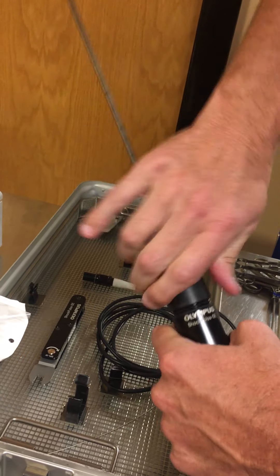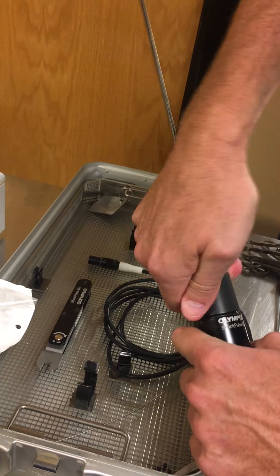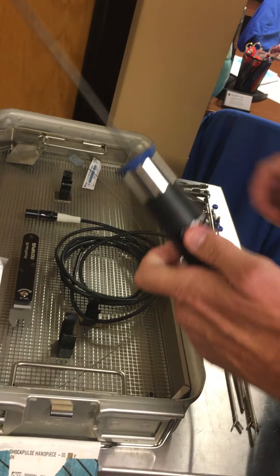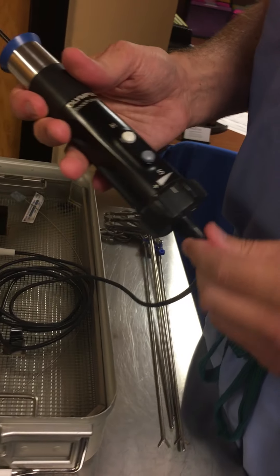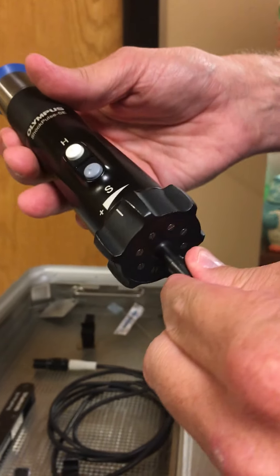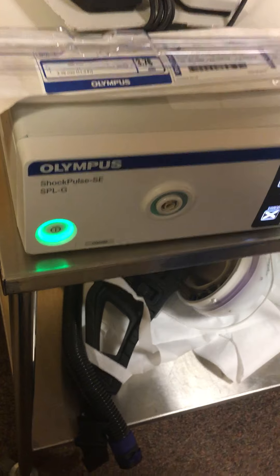Next, take the nose cone and simply slide it over the probe. Apply a little pressure, turn it clockwise — it's going to be a little squeaky — and tighten it down. The rear of the nose cone is where suction attaches, so you'll have suction tubing in the room and connect it to the rear.